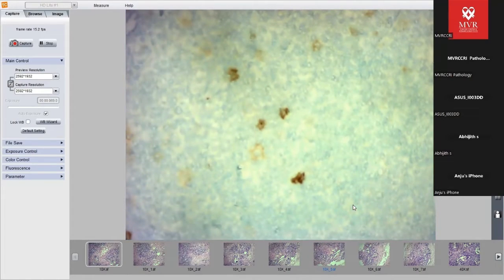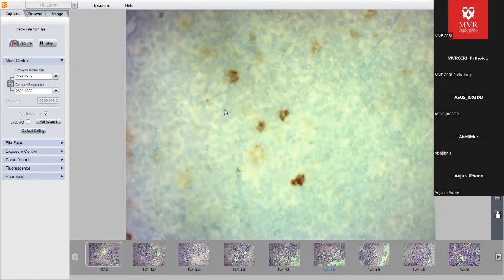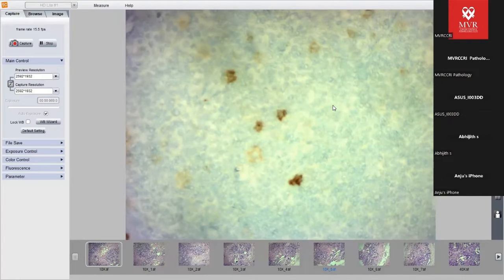So this IHC is not very crisp. The background is not very crisp. Always, when you have an IHC in lymphoma cases, try to make the background negative stained lymphoid cells look very crisp, so that we'll be able to identify which cells have actually taken up CD30. Is it just non-specific blotch-like staining, or have the RS-like cells actually taken it up?